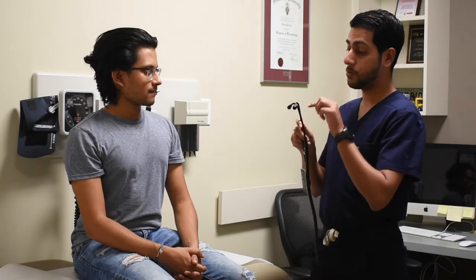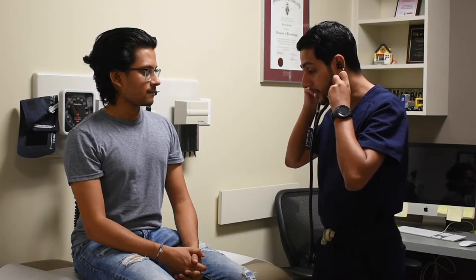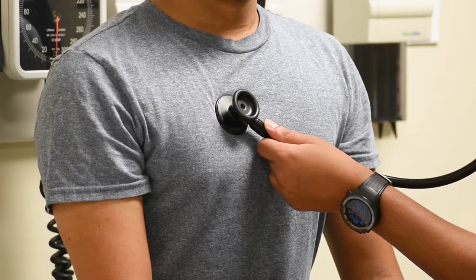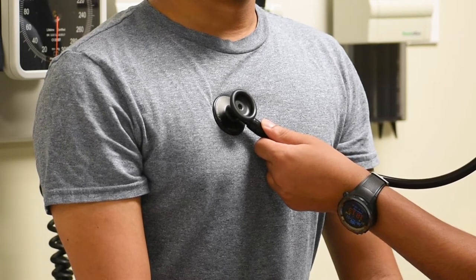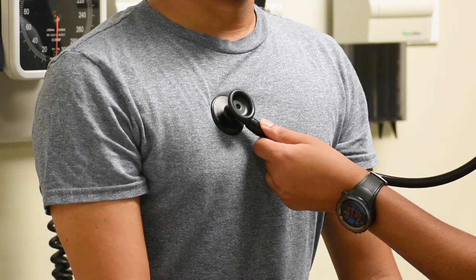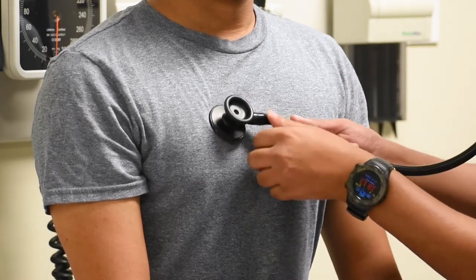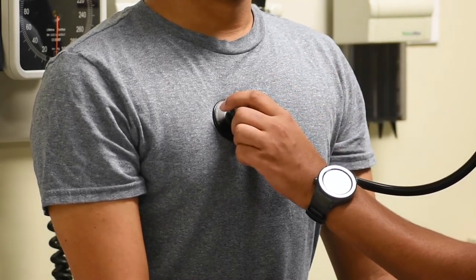It's really important to actually use it correctly. We want our prongs facing downwards — that's what we want placing in our ears. Taking the stethoscope, you want to listen very gently. When auscultating, it's important to hold it correctly so that you don't generate any other sounds while listening. There are two ways to hold the stethoscope: one, holding it away from the patient near the neck; and two, taking your hand and putting it on the bell and gently listening.